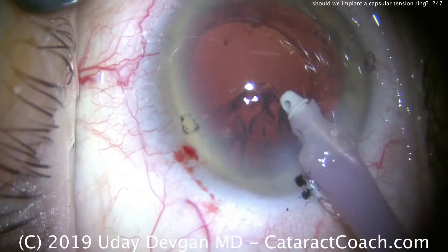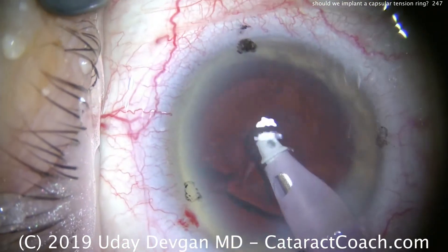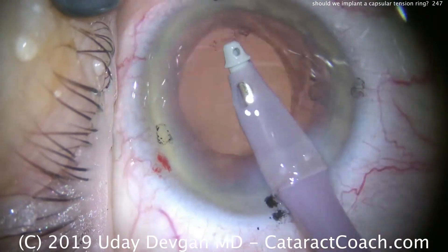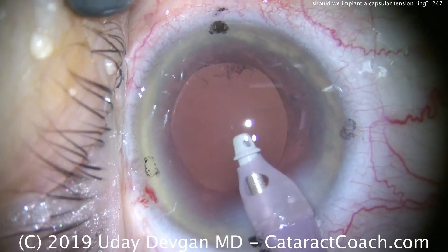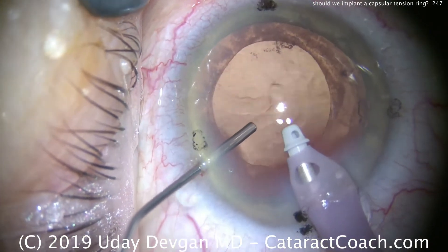Let's fast forward. Here's the end of the case — we're removing the cortex. Watch carefully. Now if we have very bad zonules, as we pull the cortex, the rhexis edge will move. And here, the rhexis edge looks pretty stable; it's still a round rhexis. That looks okay. So we didn't encounter too much difficulty in doing the cortex removal.